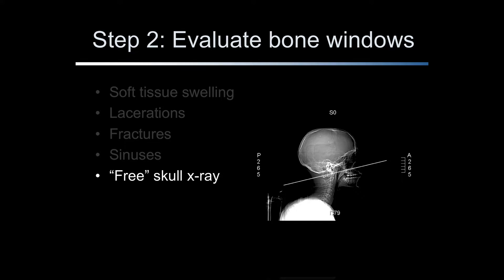A lateral skull film is used as a scout to align the scanner gantry and orient the CT slices. Certain skull fractures, foreign bodies, and post-surgical defects may be seen on the scout film. Don't overlook this image as a source of useful information.